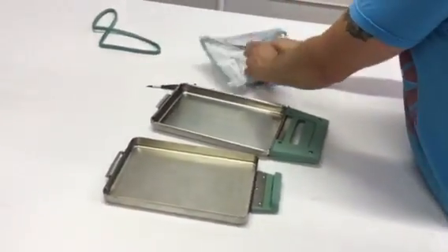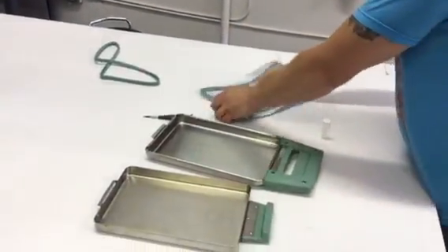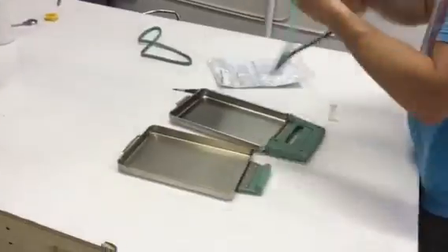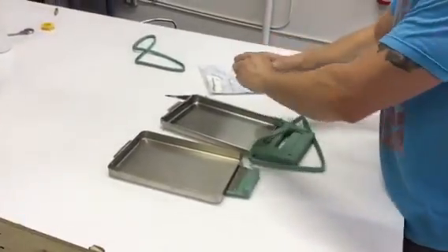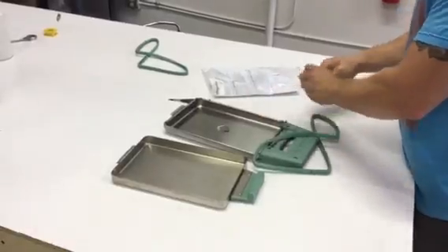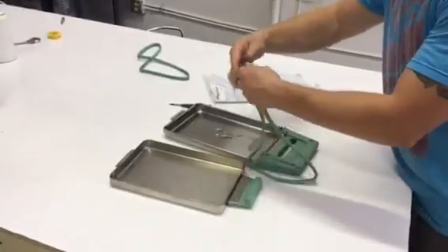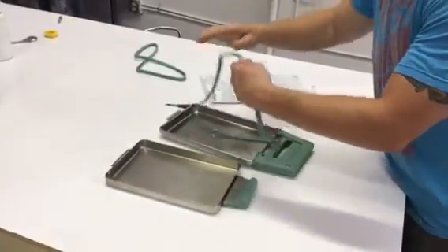I'm going to open up the seal. It comes with a little lube kit. You're going to want to take the seal, take about a quarter size of lube, put it in the center of the cassette. You're going to want to get it on your finger and lubricate the seal all the way around.